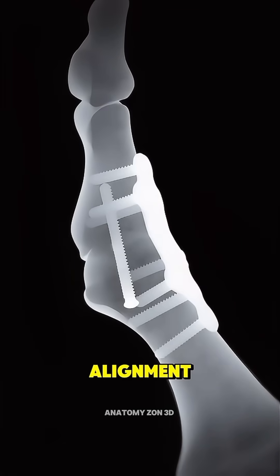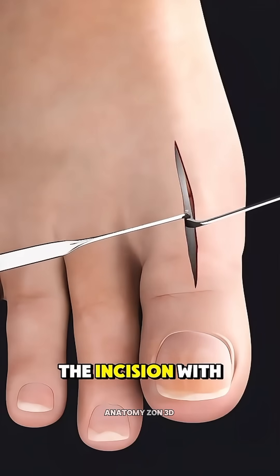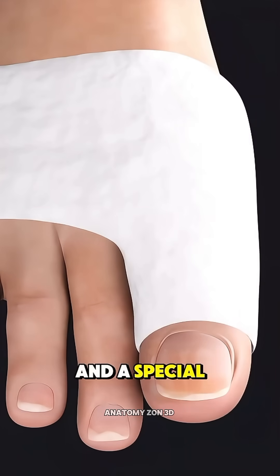The surgeon checks the alignment to be sure the toe will function well, and then closes the incision with sutures. A dressing and a special boot are applied to protect the foot.